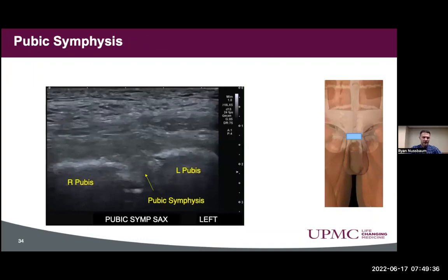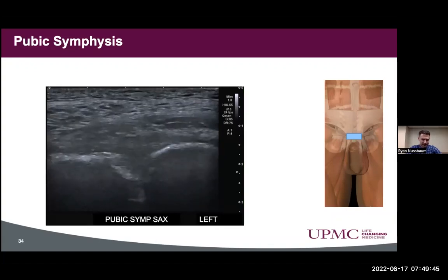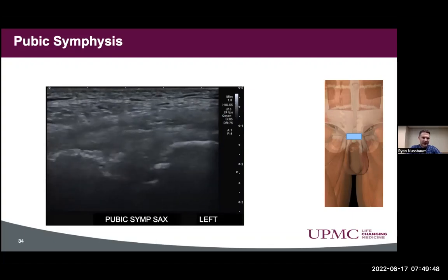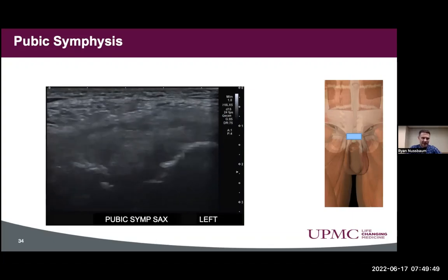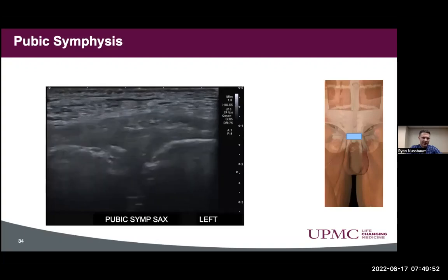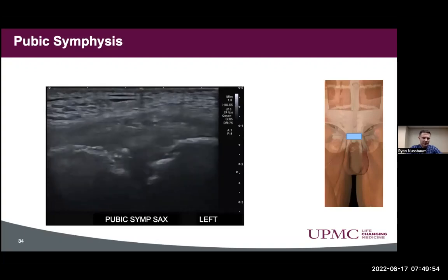We then looked at the pubic symphysis, essentially in short axis to the rectus abdominis, coming distally. As we translated through, we saw cortical irregularity on both sides, with the right being a little more severe compared to the left. There was no sonopalpation tenderness with this.